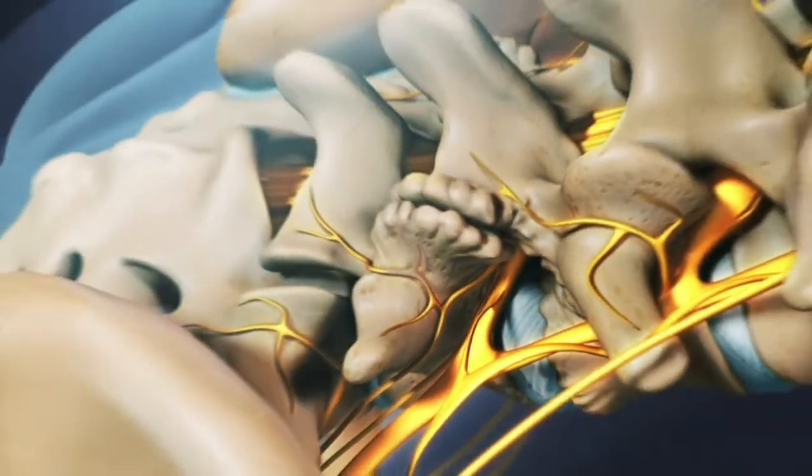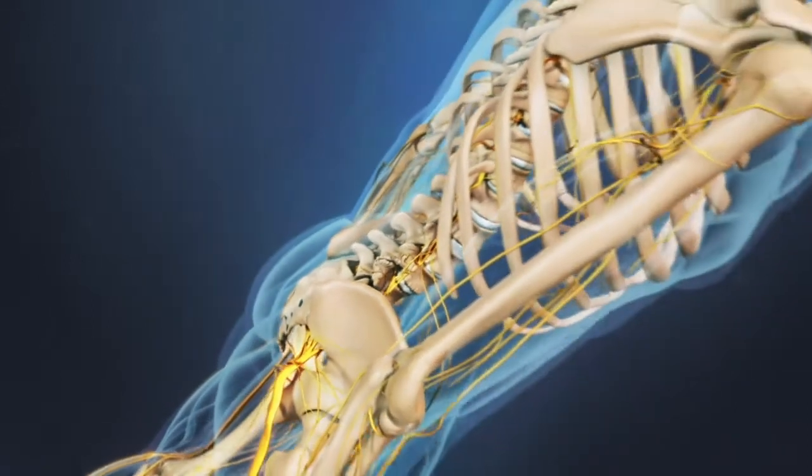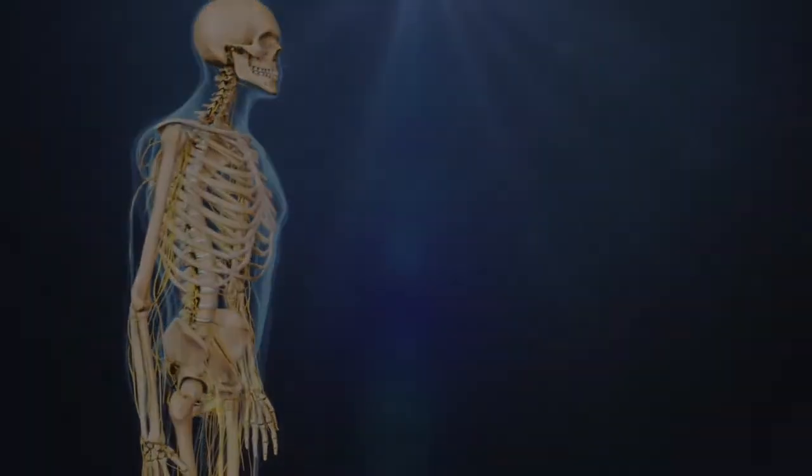As with many spinal injection procedures, radiofrequency neurotomy works better for some patients than for others. It is often helpful in reducing a patient's pain enough to participate in a rehabilitation program.